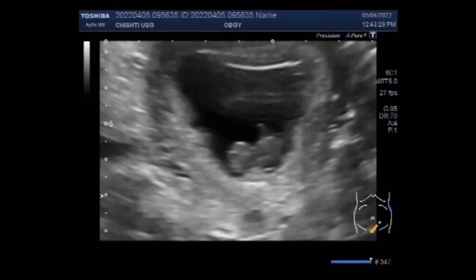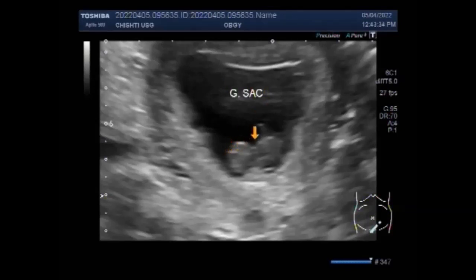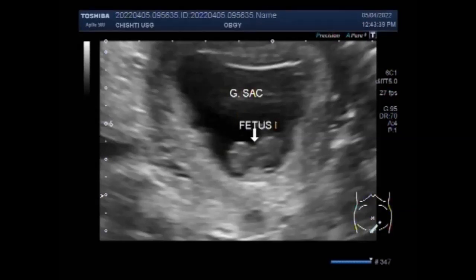Ultrasound diagnosis of miscarriage should only be considered when either a mean gestational sac diameter is equal to or more than 25 mm with no obvious yolk sac, or a fetal pole with a crown-rump length of equal to or more than 7 mm without evidence of fetal cardiac activity.